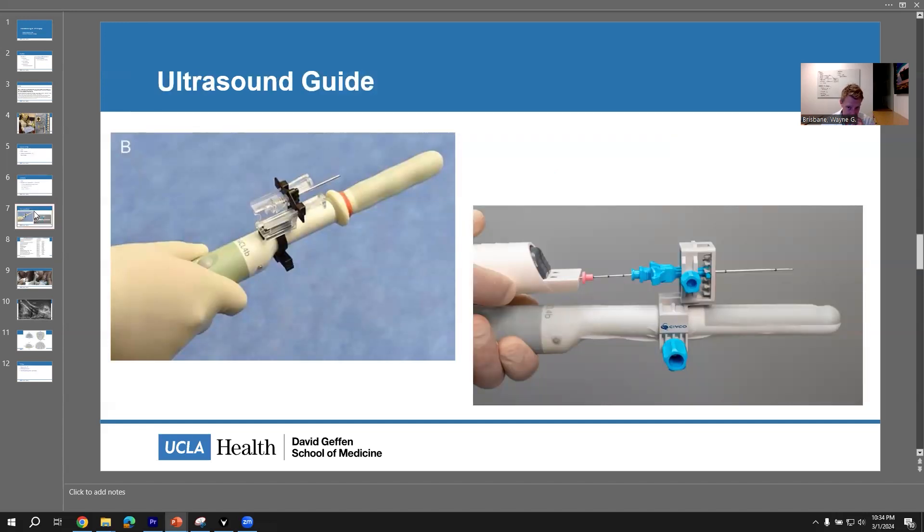There are multiple biopsy needle guides that I think can be pretty helpful. These are two of the ones that I've tried that I thought were decent: Precision Point and Pivot Pro — this one is made by Civco. Basically you poke these into the skin and then you move the ultrasound around and it keeps the needle in plane.